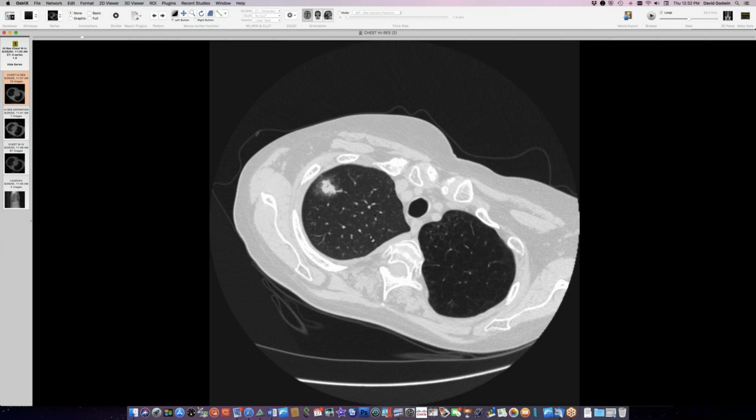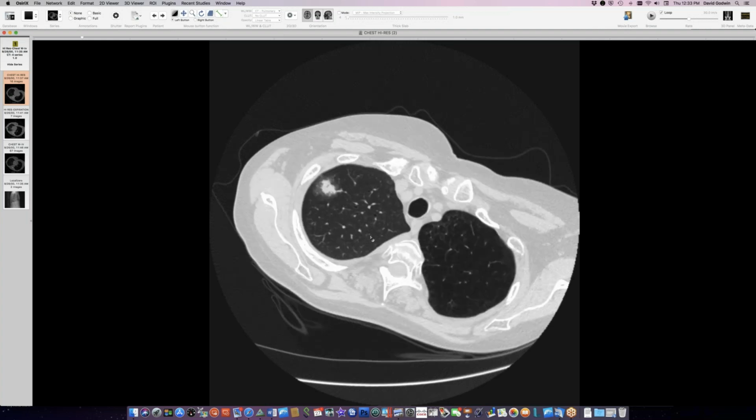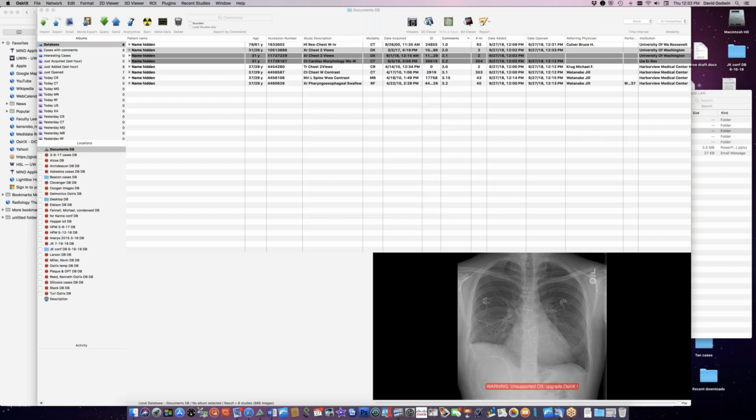This was PTLD. So do you know if it was like a malt lymphoma or any more detail about it? Because I showed a case, I think it was last week, of a multicentric malt lymphoma that had nodules with halos, and I have another case that looked like an adenocarcinoma that was biopsied that was malt lymphoma. Right. Adenocarcinoma should be on our list too. So that's another thing to add. This was an EBV positive thing. I'll look up the path and see if they called it malt lymphoma, but it was EBV related. Okay, I will check that path for you.